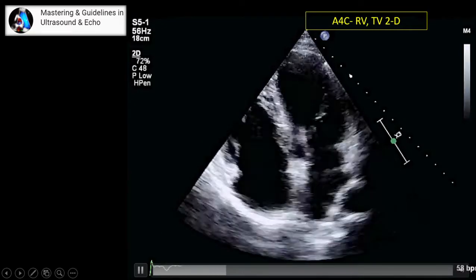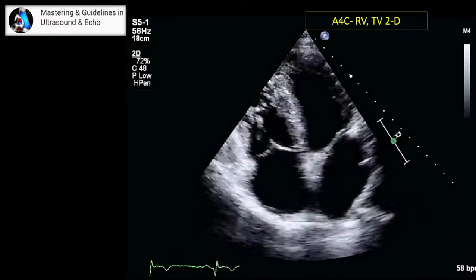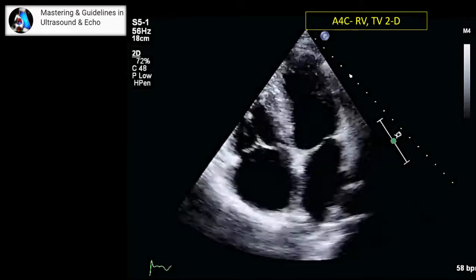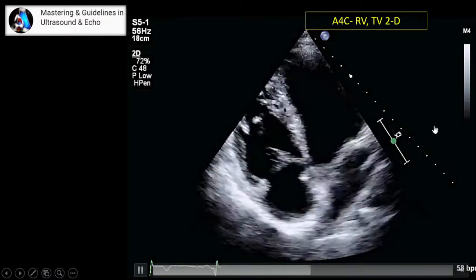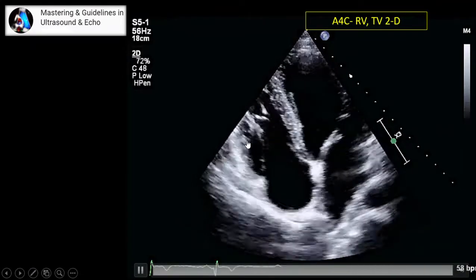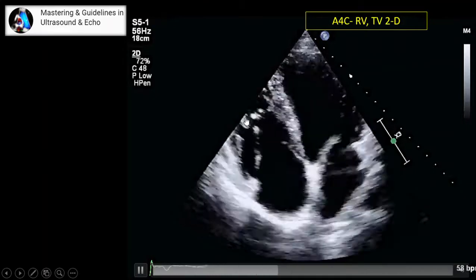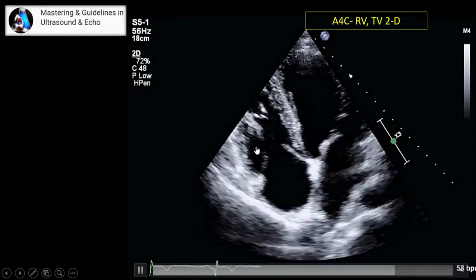After finishing left apical 5, we go for evaluation of the right ventricular function. Besides that, we did TAPSE and tissue Doppler on the lateral annulus. We have to do something extra in apical 4. One of them is the off-axis or right-focused apical 4, focusing on the right ventricular.